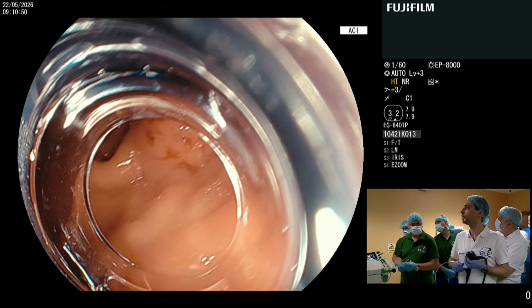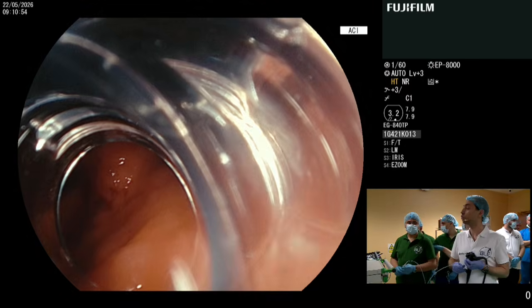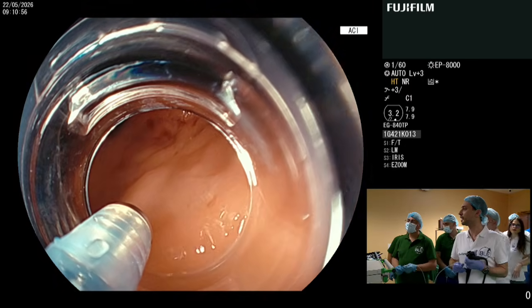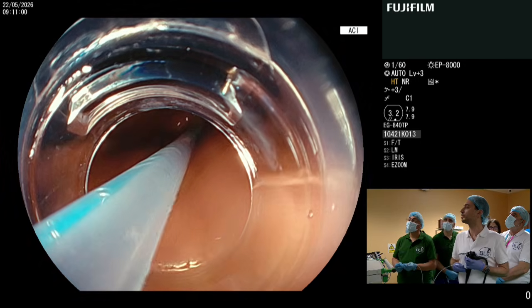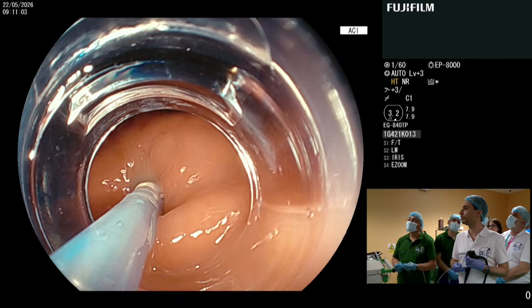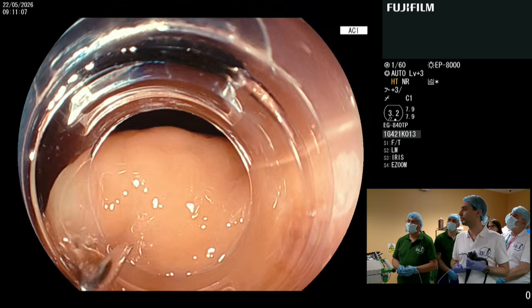Georgios, can you hear us? Yes, I can. Morning, this is Pavel. Good morning. Nice case. Quick question. What is the value of endoscopic ultrasound in determining the layer of the lesion? How reliable is it in the stomach for this size of lesion?